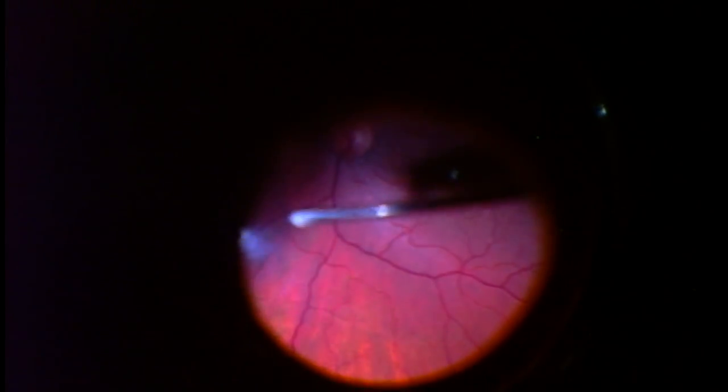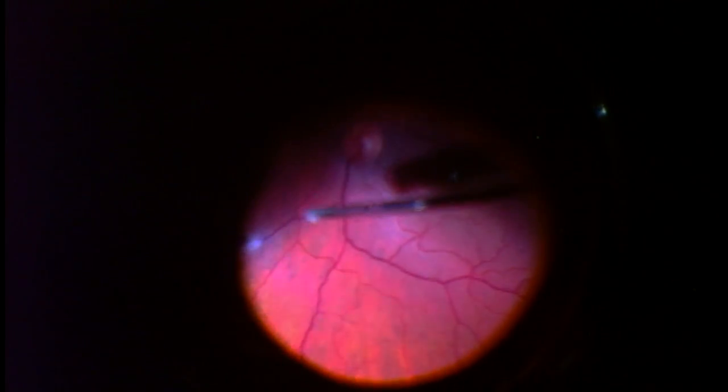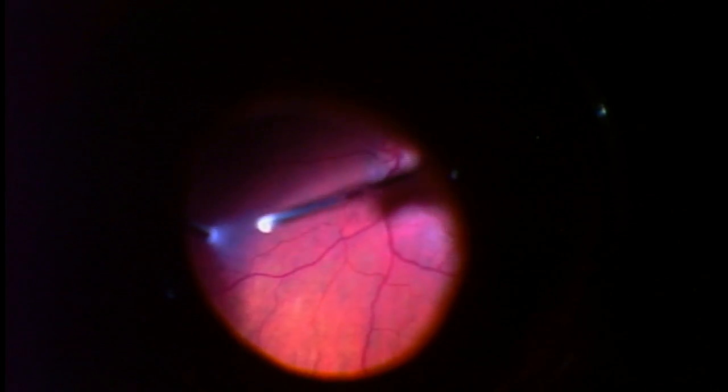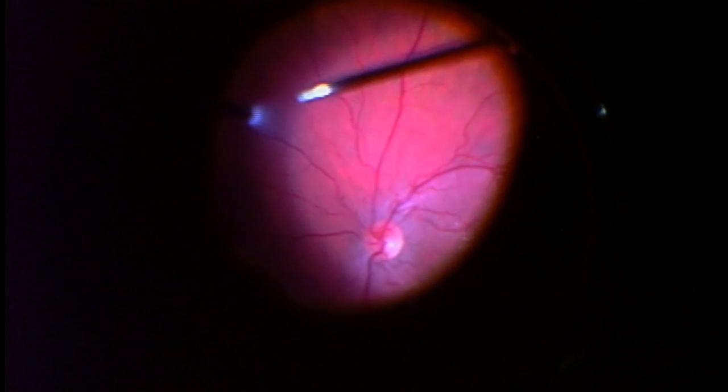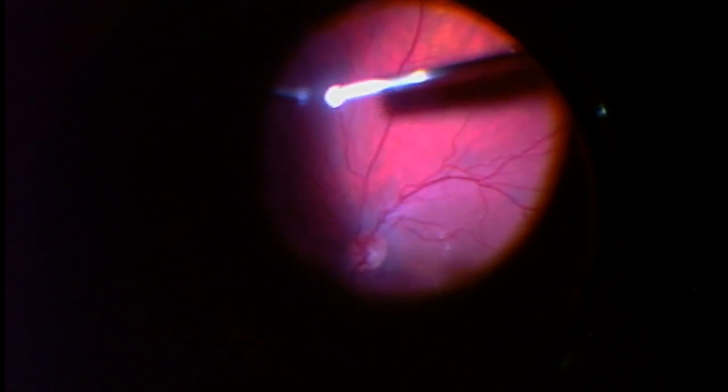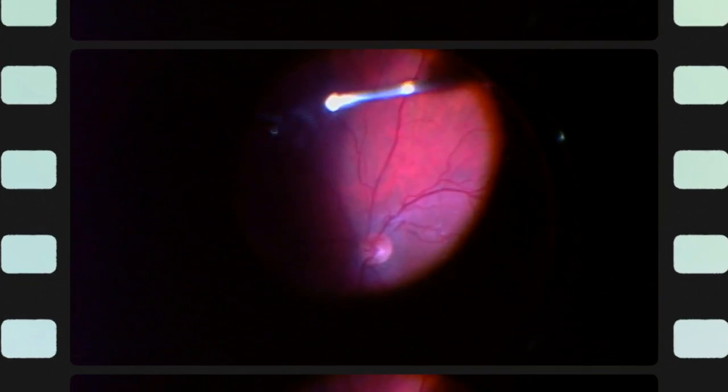One of the issues of a floater-only vitrectomy is causing tears or damage to the otherwise healthy eye. Removing the vitreous these days with 25-gauge instruments such as these has actually become quite safe. The chance of tears has reduced dramatically compared to the older 20-gauge technology.